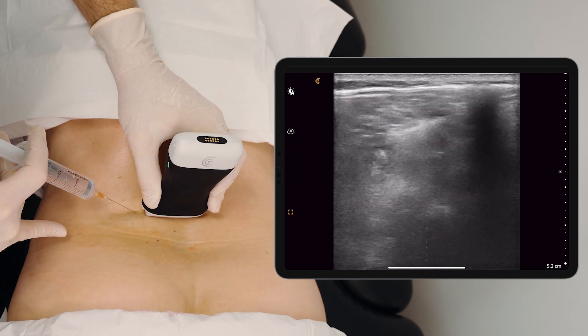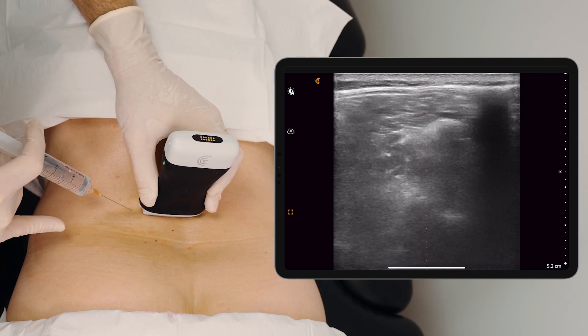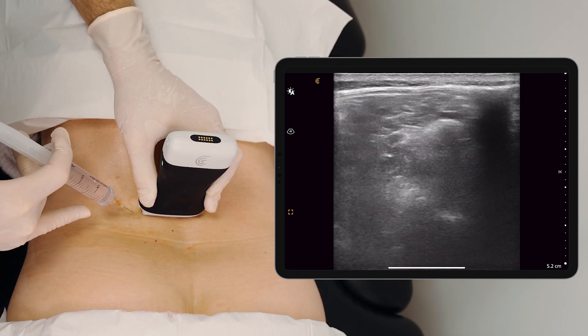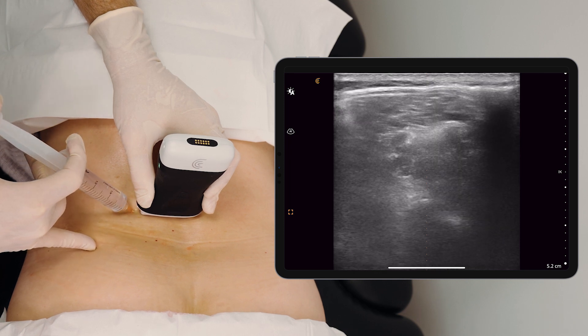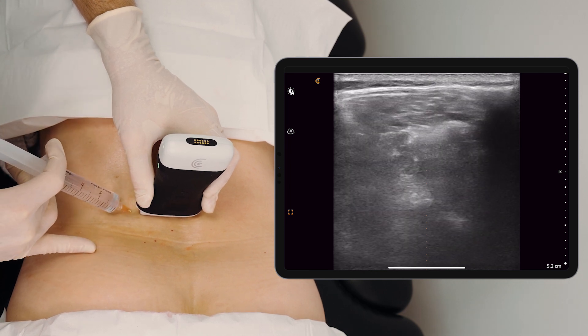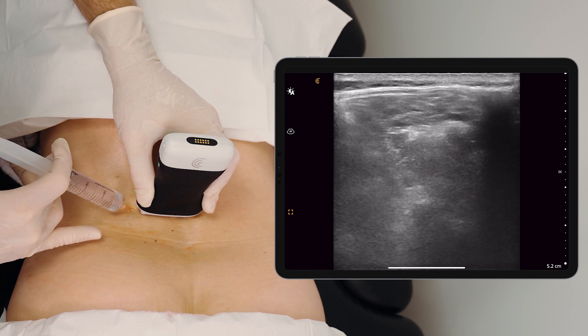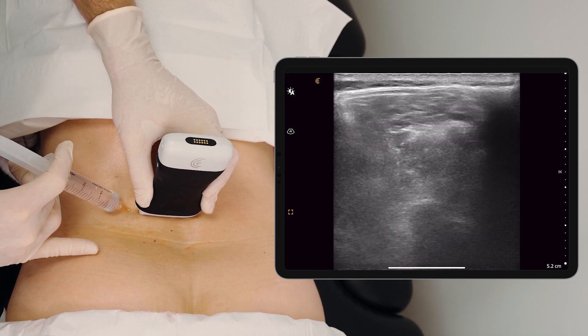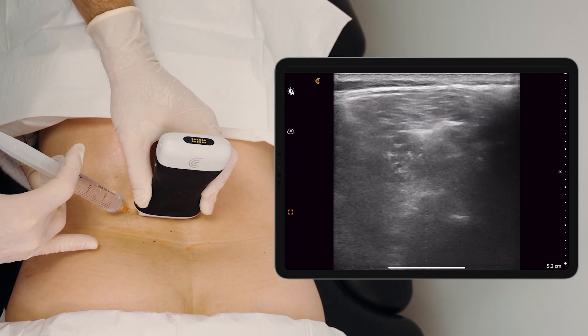Here we can see our facet joint. We place a small amount of anesthetic in the skin — a little freeze — and we travel down to the joint. You can very clearly see the needle traveling down to the hyperechoic area of the facet joint.